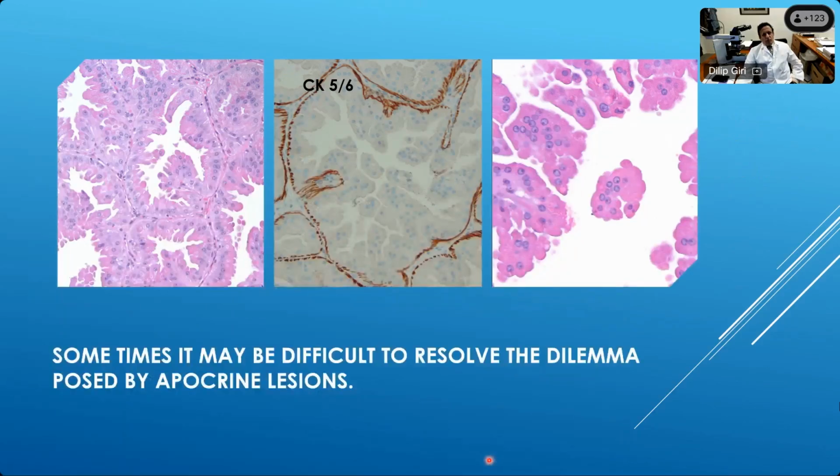And we also have to remember that some of the cell types that are involved in ductal proliferations are innately non-expressors of CK5-6, like the apocrine cells. So this is a totally benign apocrine metaplasia. So there is no point in doing CK5-6. If you do CK5-6 and you are going to base your diagnosis on that, then you will make a diagnosis of ADH for absolutely no reason.